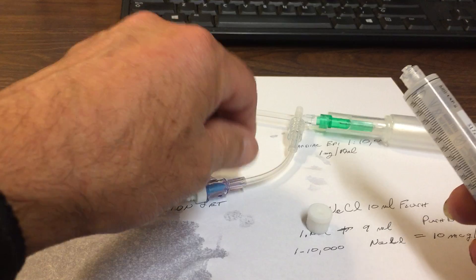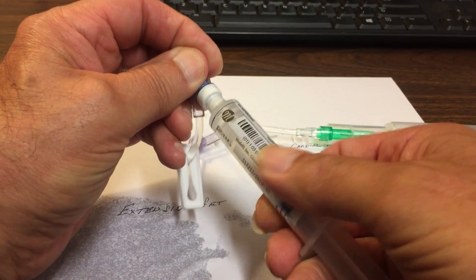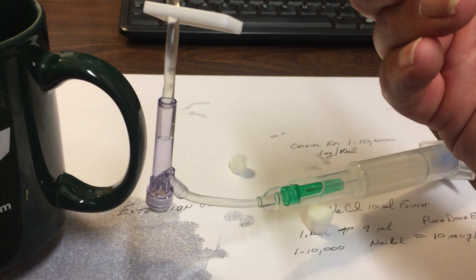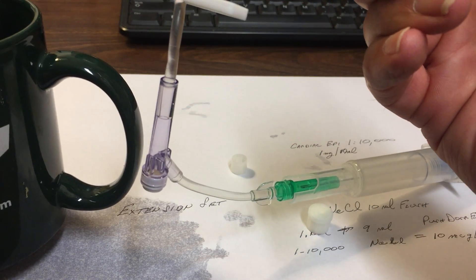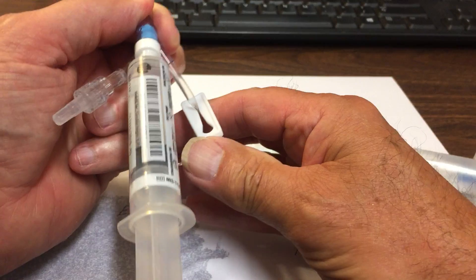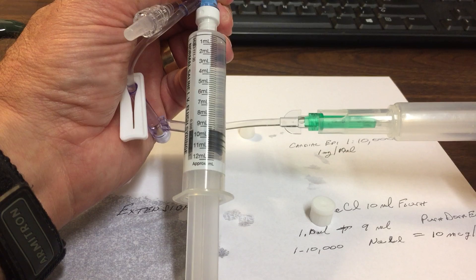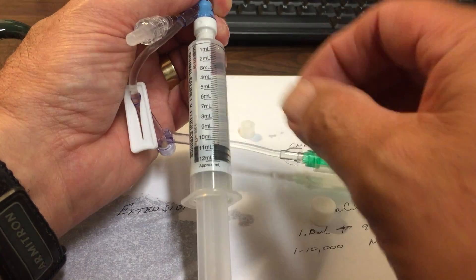We're going to push the normal saline — 10cc's — right at this needleless port. Now, we're just going to squirt out of this vial 1ml, so we're going to take it from 10 to 9. Then we're going to crimp this end off, open this up, and push 1ml of the 1 to 10,000 epinephrine into that syringe. We're going to stop right there at 10ml.